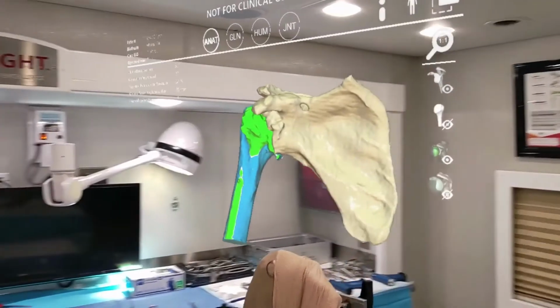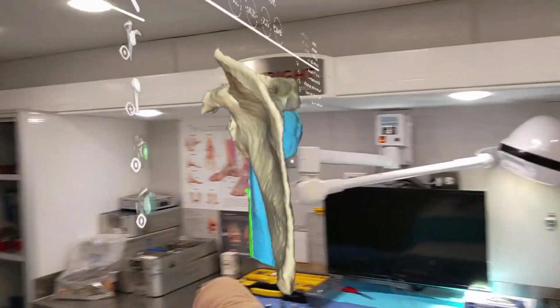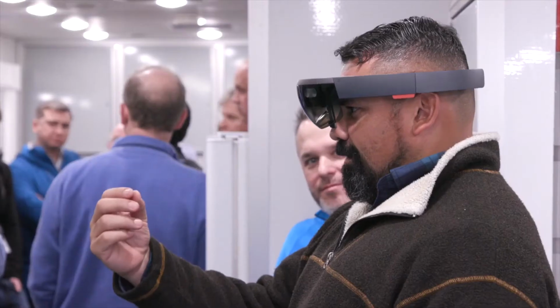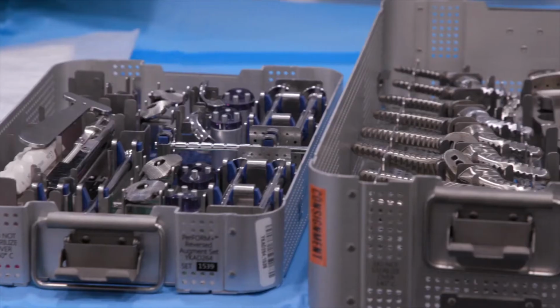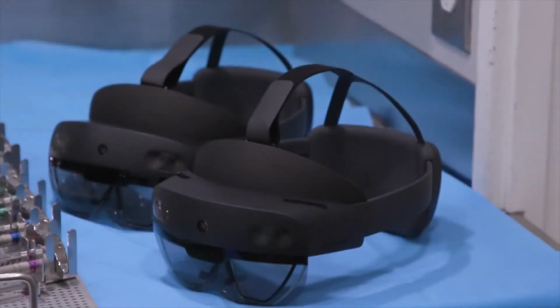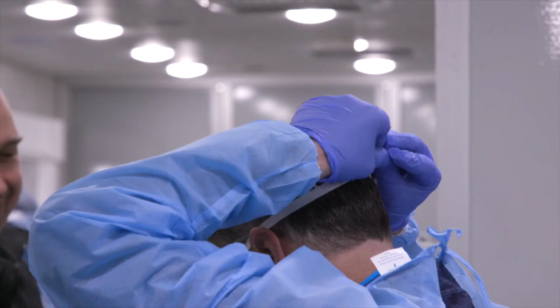Moreover, if I want to reference my plan right now, I got to walk over to the wall and look at the printout that I've made of my virtual plan. Here it's right in front of me when I need it and when I want it. This is the beginning of what will evolve into a virtual navigation, if you will, through augmented reality that will ultimately reduce our need for all sorts of paraphernalia, instruments, and guides and jigs that cost money and take time. I am currently using a guide every day in my practice in order to reproduce the exact positioning of the implants. And it works, but it's expensive. I believe that in the future, with a mixed reality, we will solve that problem.